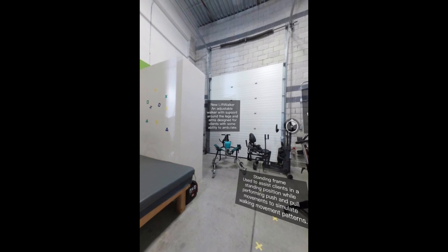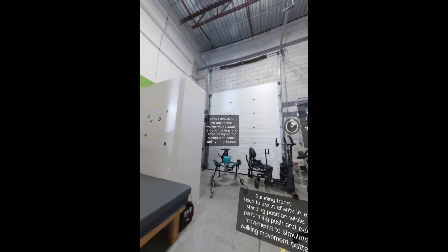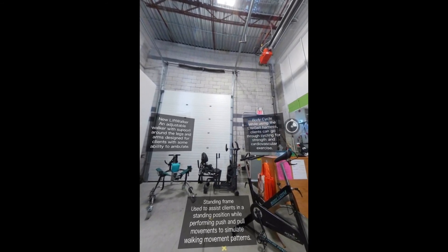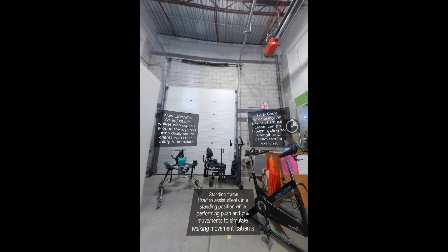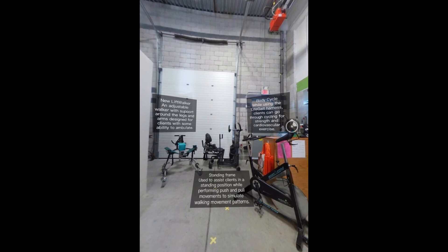The New Lift Walker is an adjustable walker with support around the legs and arms designed for clients with some ability to ambulate. The Standing Frame is used to assist clients in a standing position while performing push and pull movements to simulate walking movement patterns.